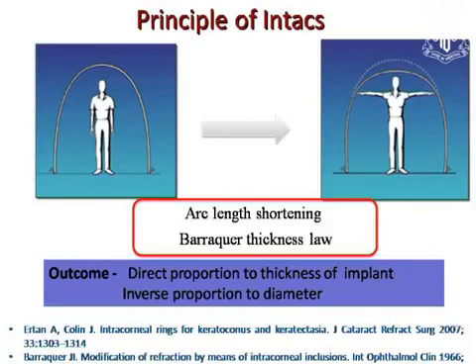INTACS works on the principle laid down by Barraquer's thickness law, which states that the flattening effect is directly proportional to the thickness of the implant. It means if we put in a thicker implant, the stretching will be more and the flattening will be more.